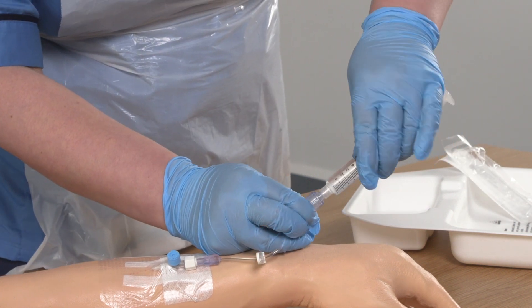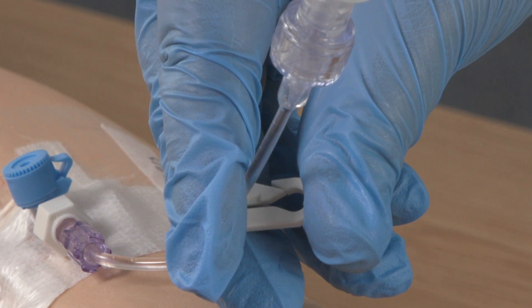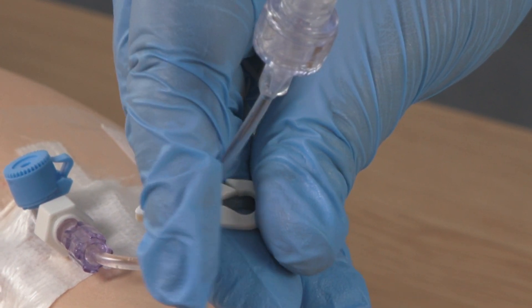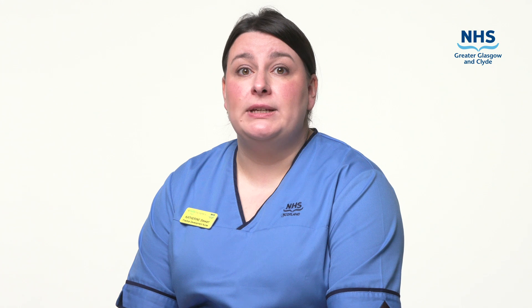Now that the solution has dried I can connect the syringe to the needle-free access device. I have already ensured there is no air in the syringe, but holding the syringe downwards stops any micro bubbles present from entering the patient. Hold the syringe plunger and undo the clamp. The clamp may be part of the vascular access device itself or on the needle-free extension. It is important to reposition the clamp every time you use it as you do not want any kinks or indents in the line. Reposition the clamp slightly and if there is any slight indentation present, roll it gently between your fingers and thumb to remove it.